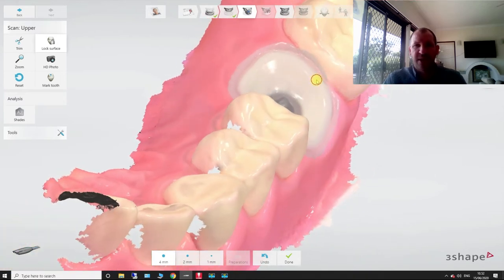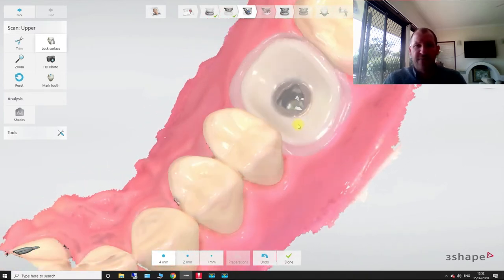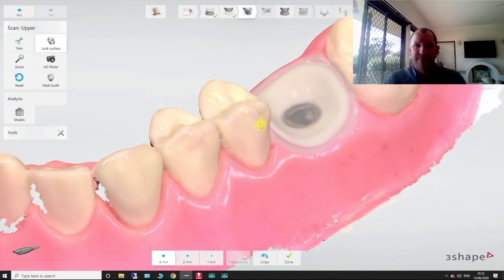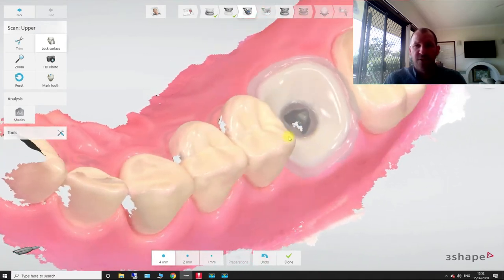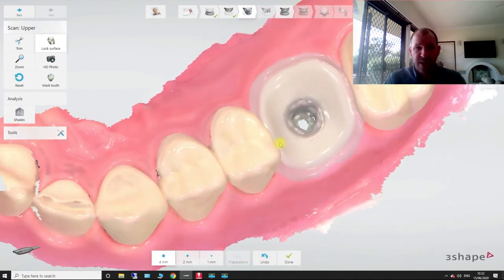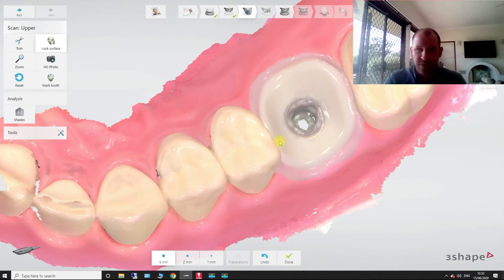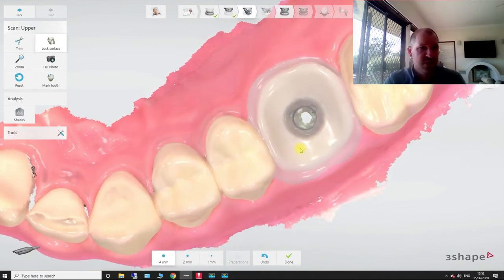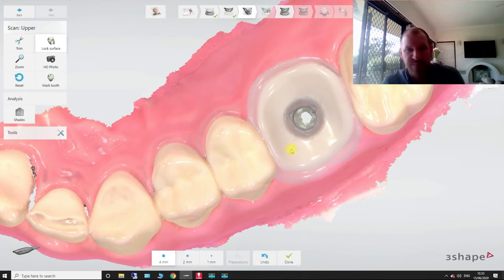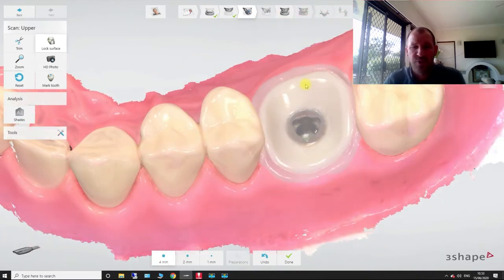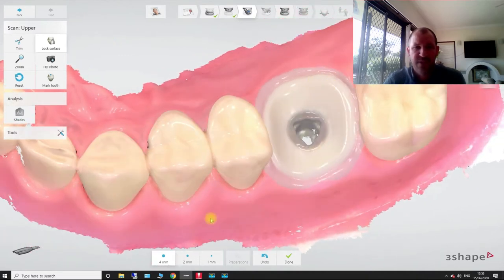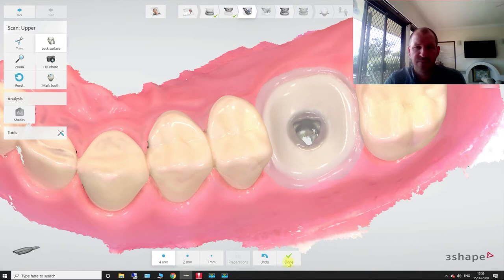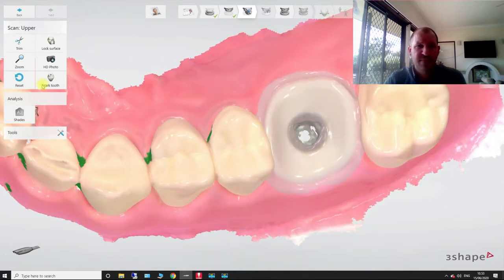I don't want to have any blood or I don't want to have any part of my emergence profile start to collapse. So if I were to put anything else over the top of there, that's not going to give me any issues. So hypothetically, if blood would have built up in this area, it's not going to get written over the top. Or if the tissue starts to collapse, it's not going to get written over the top and alter the scan from where it is at that point in time.